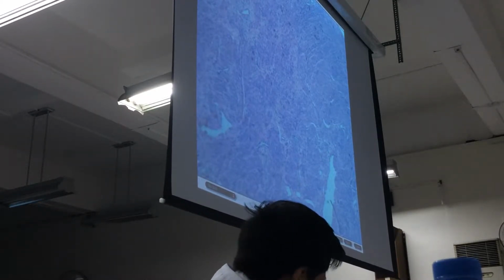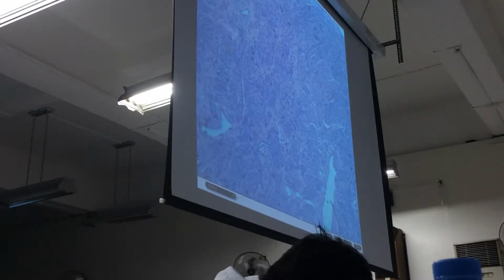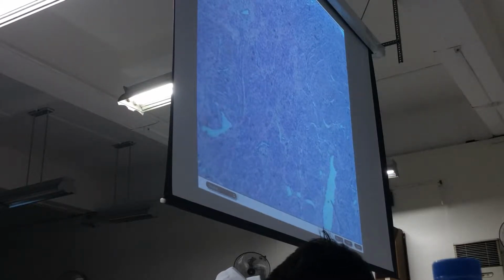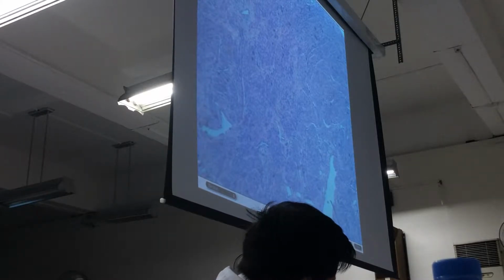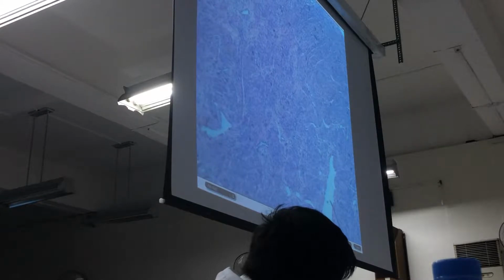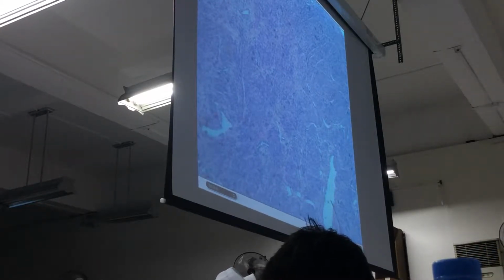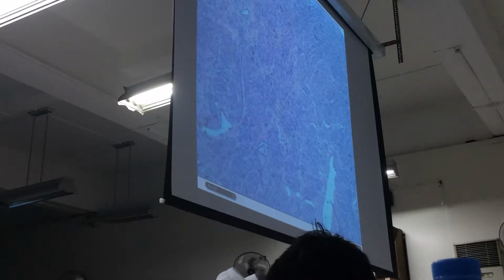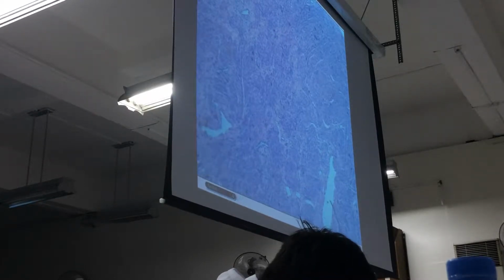M1007 is atrophy of the uterus. M10012 is labeled as simple hyperplasia, but actually it is an endometrial polyp, so that's a mislabeling. M1023 is proliferative endometrium, and M1037 as well as M1087 are both leiomyomas.